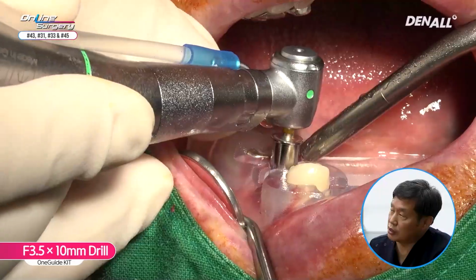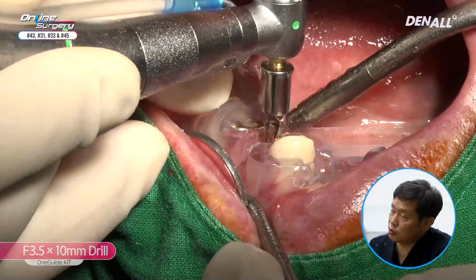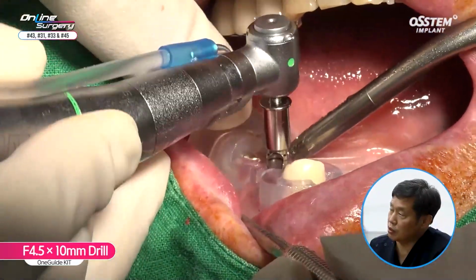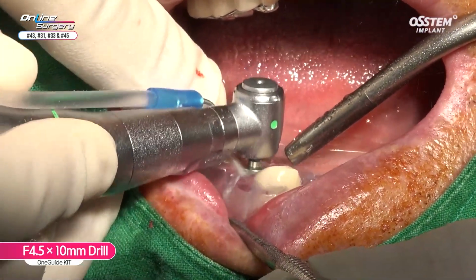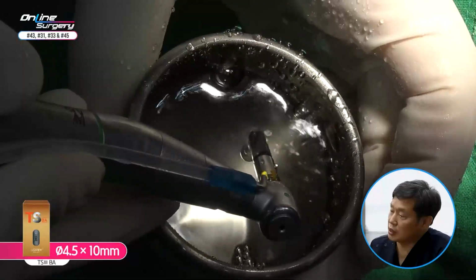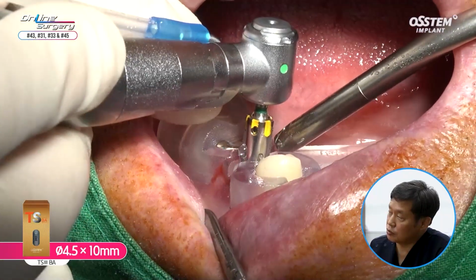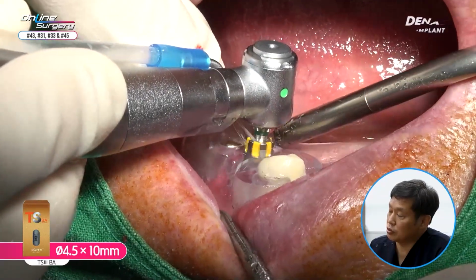3.5 by 10mm drilling was done. When placing an extraction socket, there can be slipping. Next is 4.5 by 10mm OneGuide drill. TS3 4.5 by 10mm implant was placed. Implant was positioned with irrigation. It was placed about 70–80%.